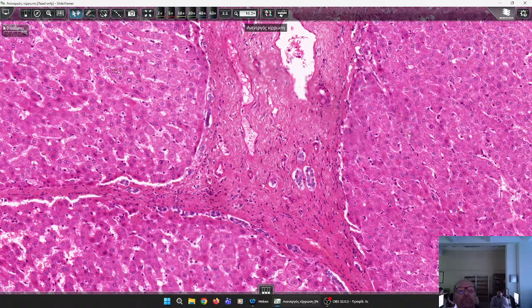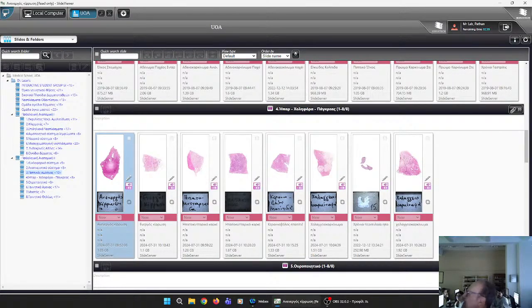No inflammation. Yes, I have the eye, I catch the fields. But this is a very good example. Of course, because I'm the professor. Yes, it's true.